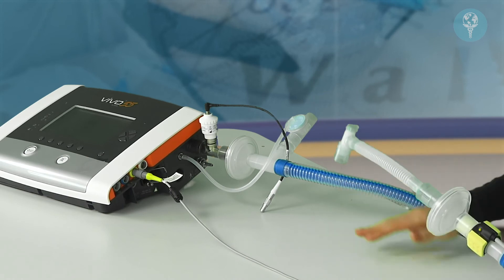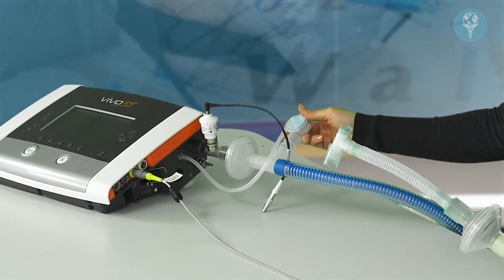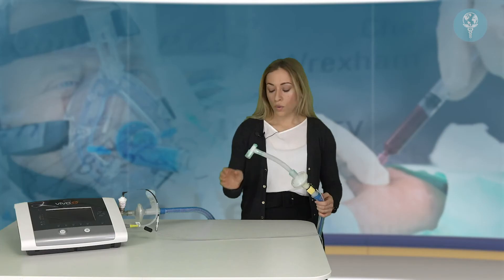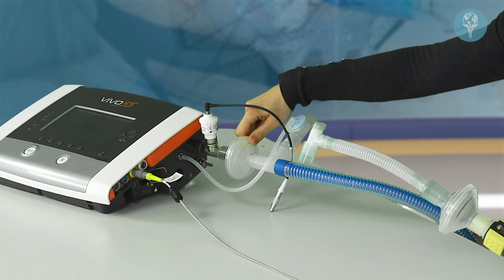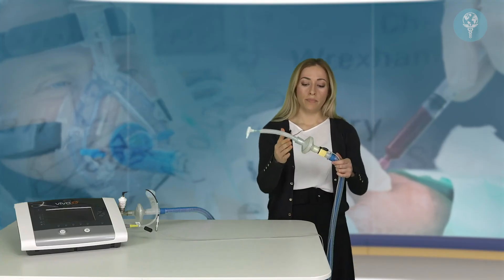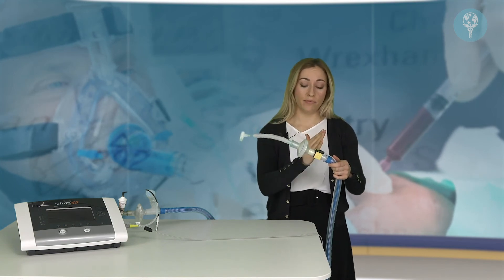Just to go over a couple of important points. This is the active exhalation valve at the end of the circuit — make sure this little rubber tube is always connected to the side of the device. Always make sure to have two filters in the circuit when treating a patient with COVID-19: one at the device end of the circuit and one before the exhalation valve, coming from the patient.